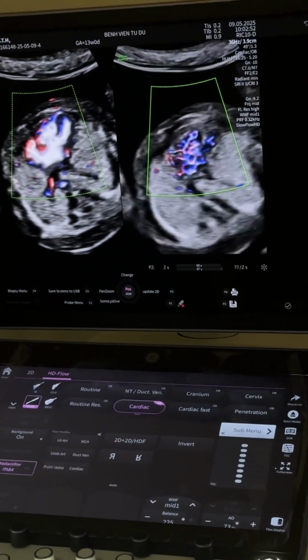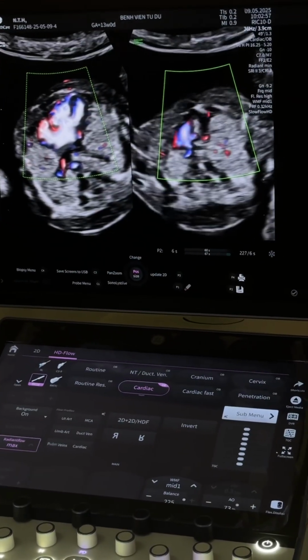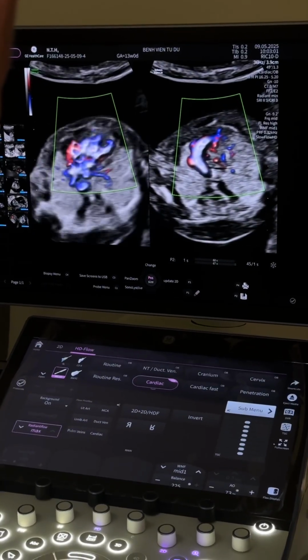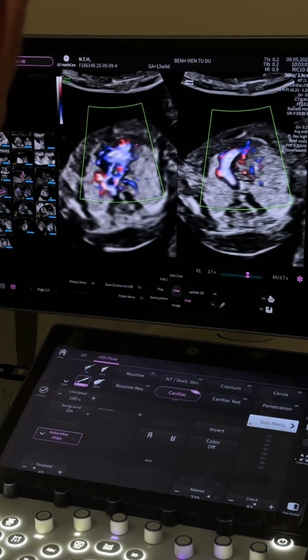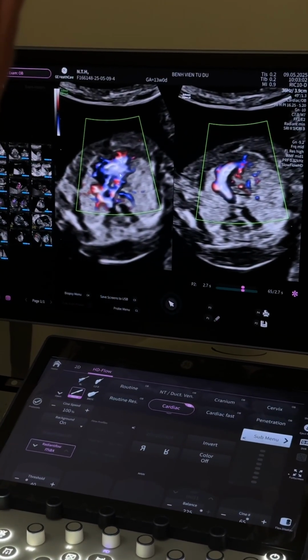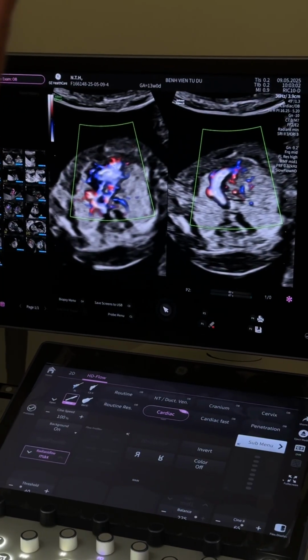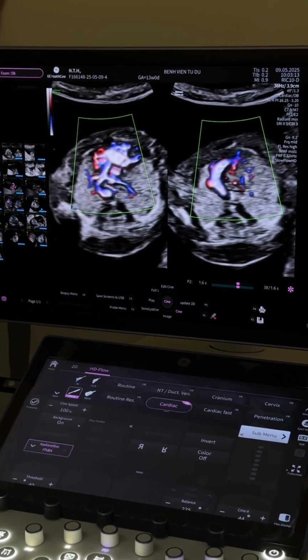And maybe stop moving. The aorta just coming out from there, reverse boomerang. And then inferior to this, these are the branch pulmonary arteries, which are very small. So this is the branch pulmonary arteries coming out here and here. That's why I'm struggling to see them, because they are extremely small branch pulmonary arteries coming out.